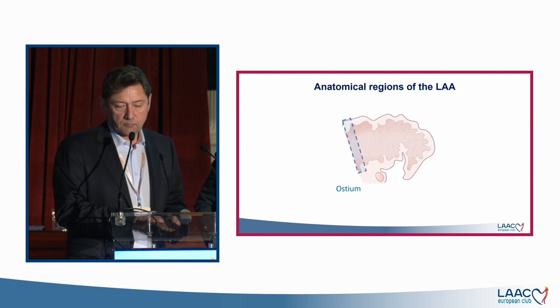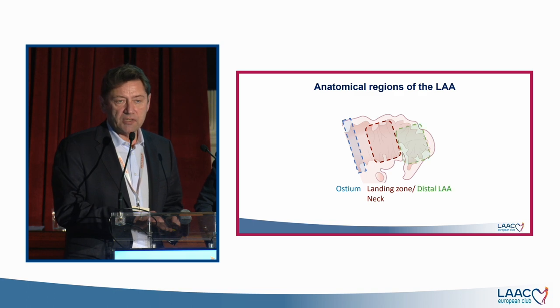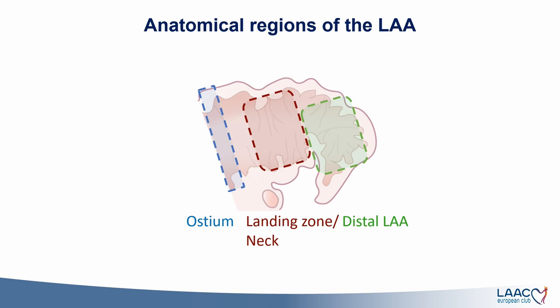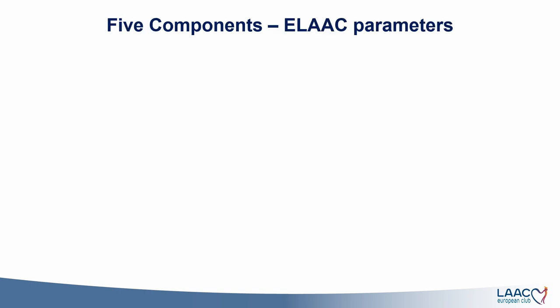They are the region of the appendage. They are probably part of the classification. Of course, we know what the ostium is. Landing zone, as Sergio said, is not anatomical, but something device specific, but also the distal part of the LAA that can be involved in terms of shape, but also angulation and function.